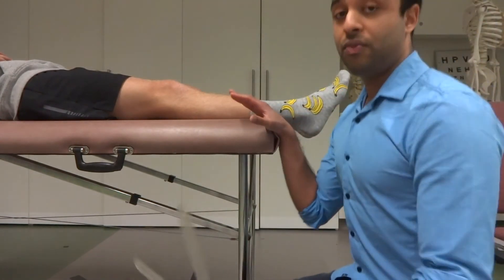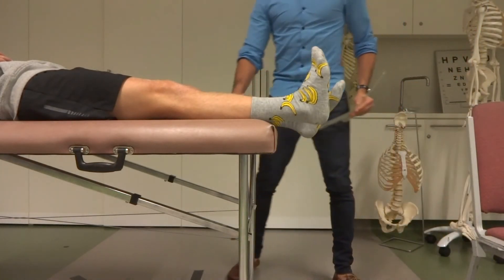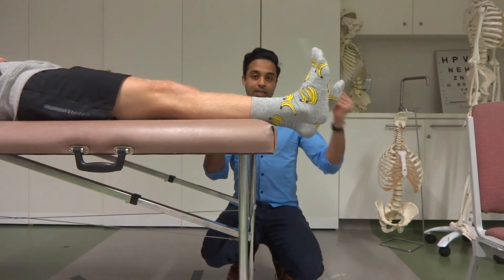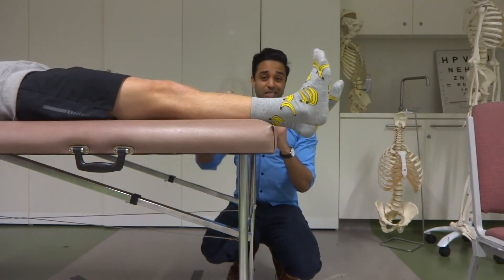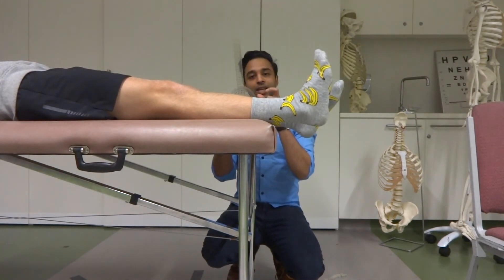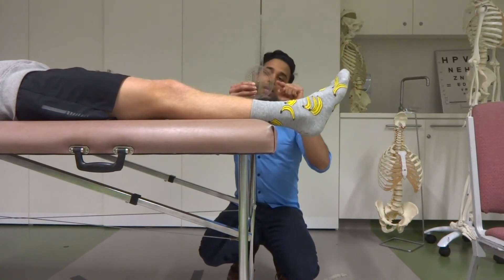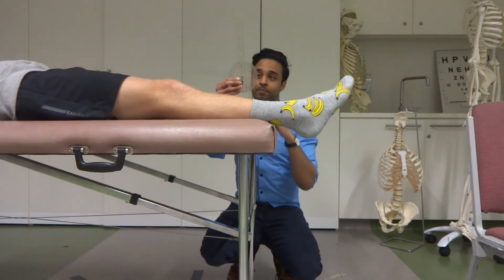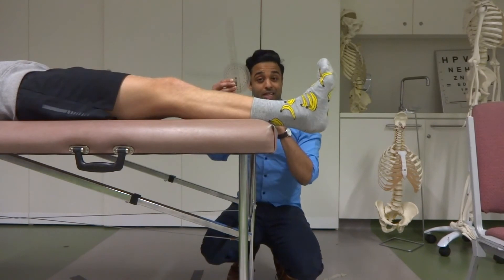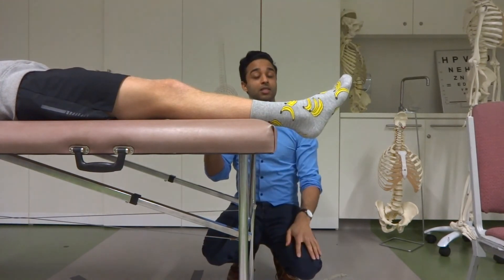The key thing to remember with ankle measurements is that the neutral ankle position looks like 90 degrees, but remember that's anatomical position, which is defined as zero degrees. If I read the black numbers on the goniometer, it says 80 degrees. But since 90 degrees is defined as zero, I take the difference — 90 minus 80 is 10 degrees. Or instead of the black values, I can look at the red values on the outside, which line up with 10 degrees. So the dorsiflexion range of motion is 10 degrees.